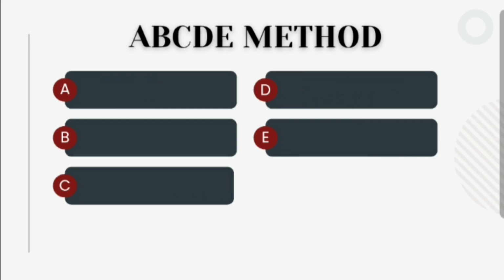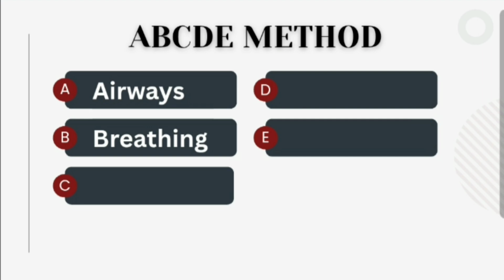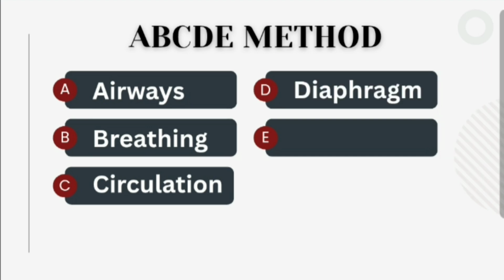The method recommended to be used in medicine for chest X-ray interpretation is the ABCDE method. A is for airways, that is trachea and bronchi. B is for breathing, that is lung fields. C is for circulation, that is heart and vessels, especially pulmonary vessels, heart borders, and aortic knuckle. D is for diaphragm, and E is for everything else, for example, bones and soft tissue. So, in medicine, we interpret the chest X-ray from inside to outside. Let's discuss this one by one.